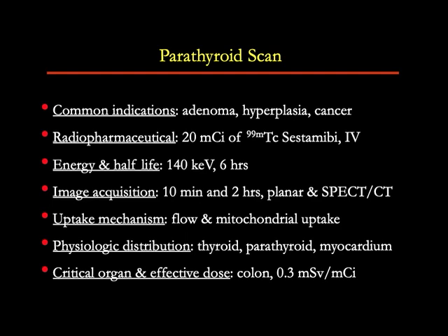Technetium-99m has a photo peak of 140 keV and a physical half-life of 6 hours. The mechanism of uptake of this radiopharmaceutical is blood flow to the adenoma and mitochondrial uptake of the pharmaceutical.